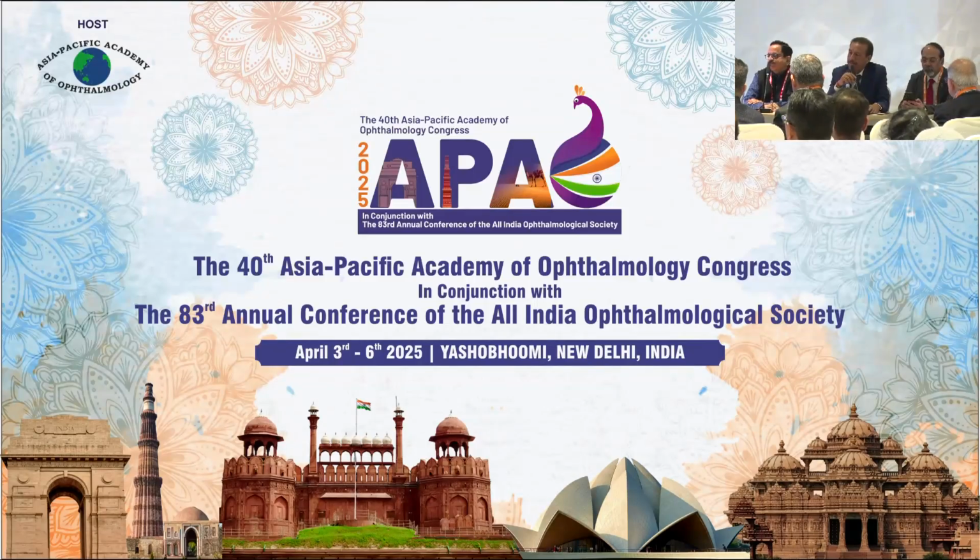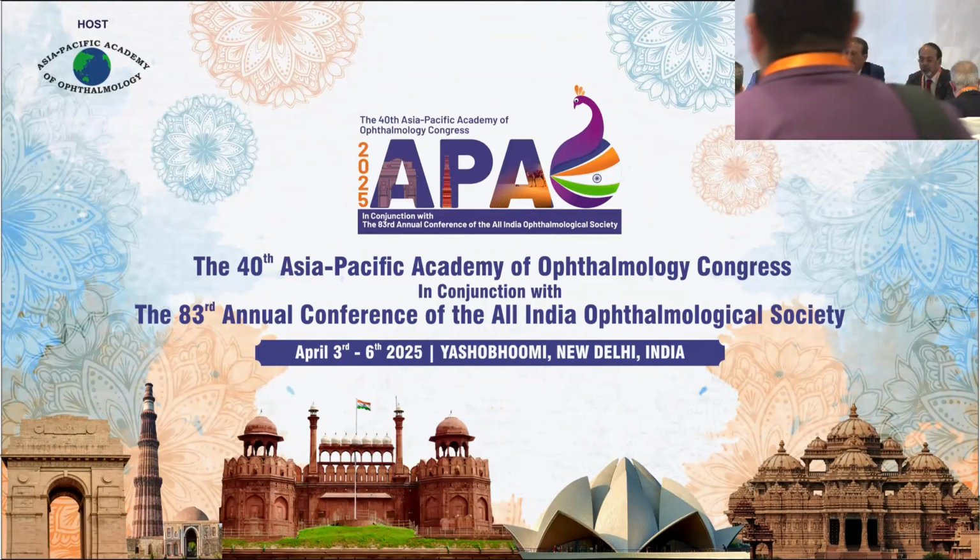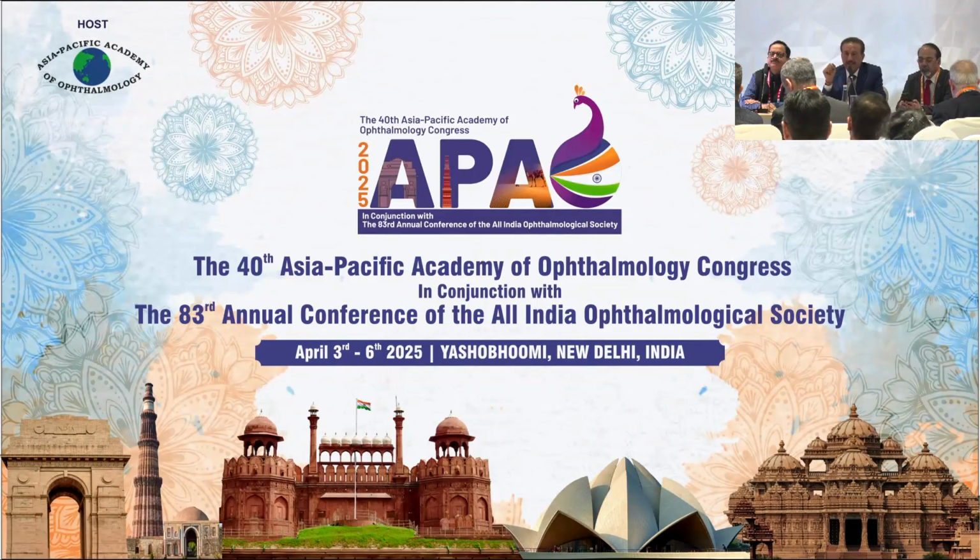cataract surgery, phaco surgery. And how you manage the posterior capsular rent is very important, because it's not that we do not get the posterior capsular rent, we all get the posterior capsular rent. But how you manage it is very important, because you can give a 100% result to the patient even after the posterior capsular rent.